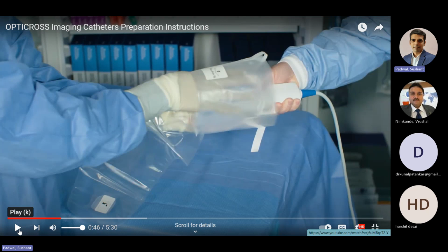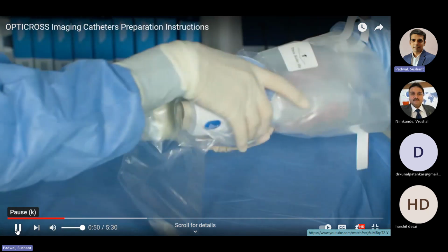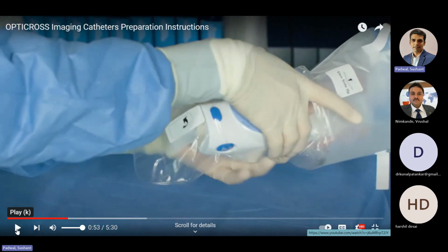You won't have to play around while doing that. I'll repeat it. The non-sterile operator will place the motor drive into the opening of the bag with the faceplate pointed up. In this way, the non-sterile operator holds the MDU and the sterile operator tries to push the plastic behind till the point where the connector comes in contact and he attaches the connector. After that only, the non-sterile operator releases it or pulls the plastic behind.